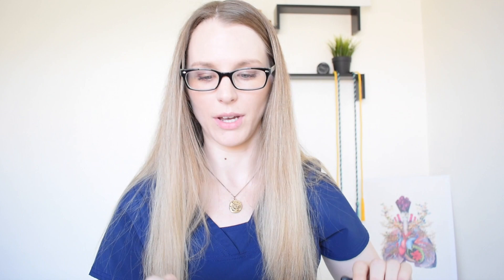Let me show you what this looks like in the case. Inside you've got your holder for the stethoscope — this is the Finesse II. The other side has a little zipper pouch, and it came with a little card that tells you about the company, plus some extra earpieces.